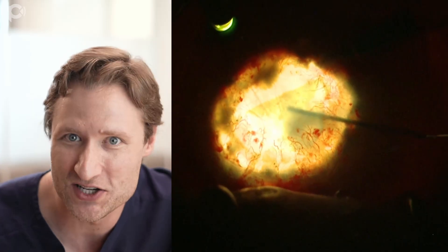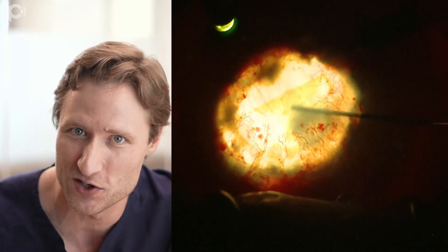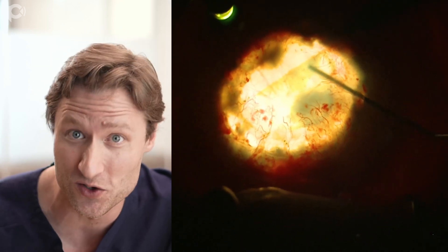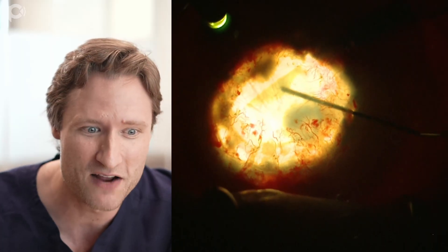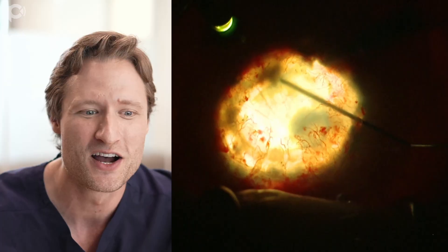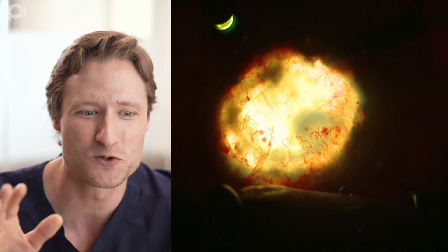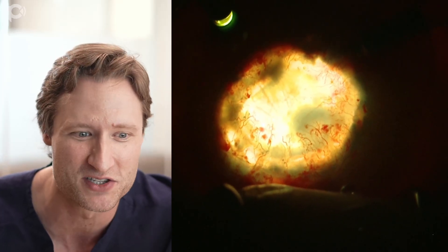When I'm doing difficult cases like this, I always request DMEK tissue from a donor 70 years old or older. If you use tissue from a 60-year-old, 50-year-old, or 40-year-old, it can be tightly curled, and if you have a tightly curled graft it just makes it more difficult to unfold. The elastic tendency of this graft is not so great - it wants to open up. So with just a few little encouraging motions with the cannula, I can completely unfold the graft on top of the patient's IOL.